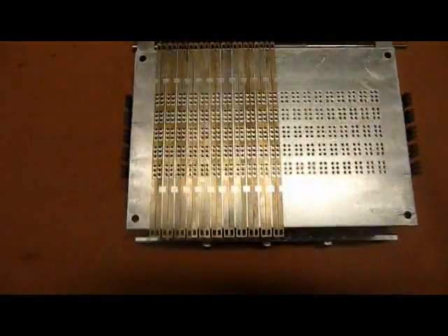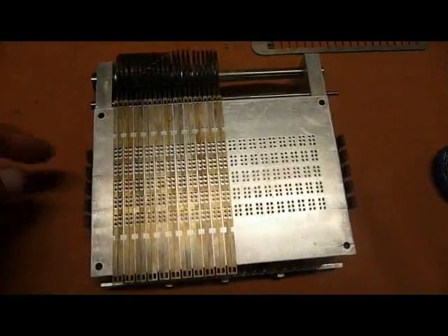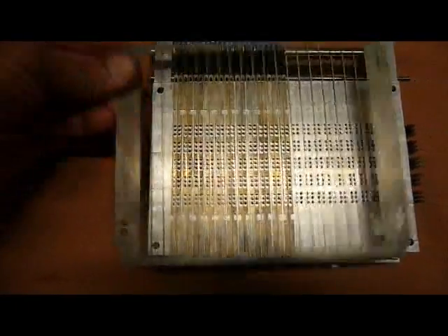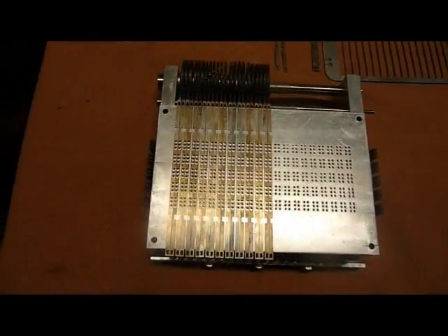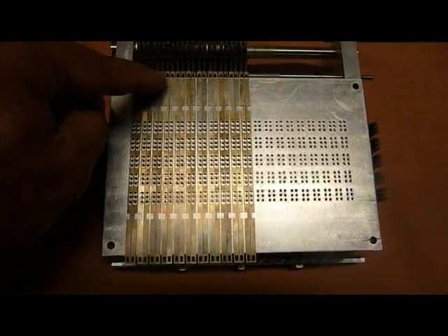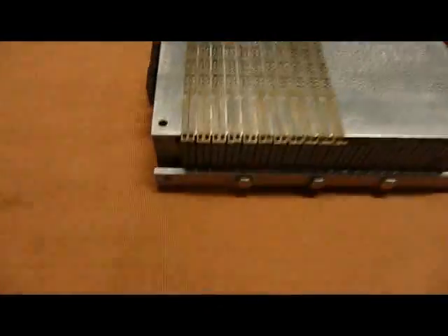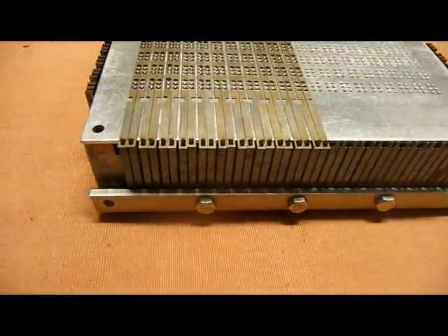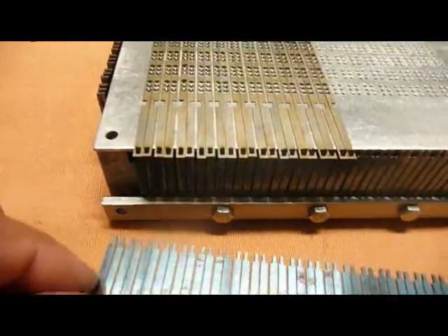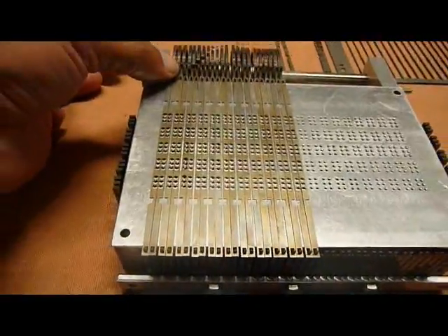I've mounted a whole lot of these slides here without the guide. The guide would come over this like that. But for the time being, I've left it open so that you can see how the cams actuate. The slides are attached at one end to the levers over here, and at the other end to a spring, a comb spring like this, so that they are always in a position where they are locked.